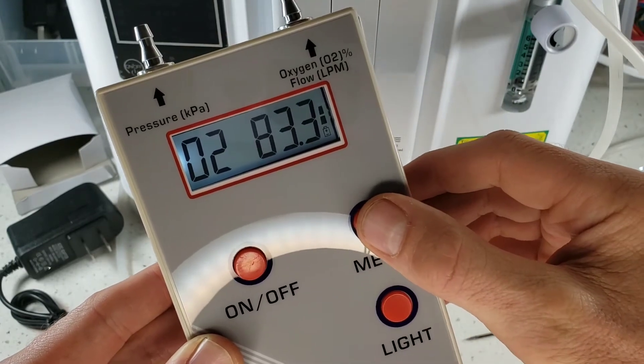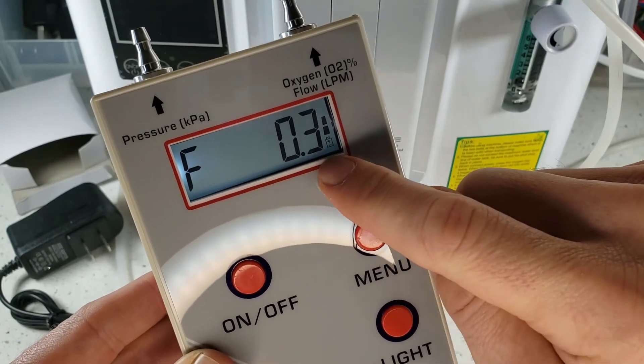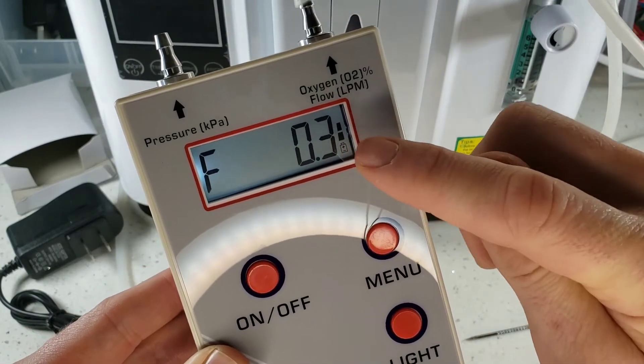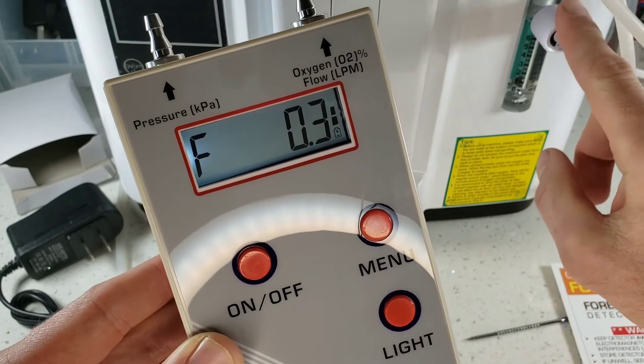Now let's check our flow rate. Connect it up, press the button, switch to flow mode. Here we are: 0.3 liters per minute — much more accurate than these analog meters. You can see with good fidelity what your flow is with this meter, much better than the old analog gauges.